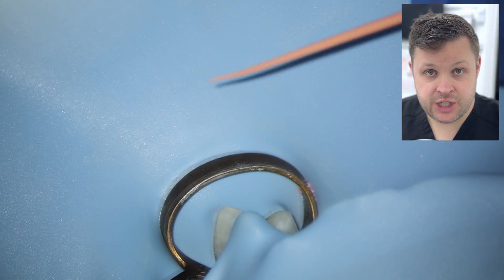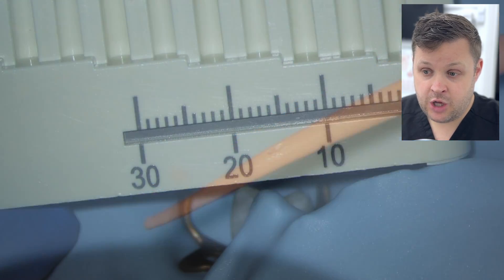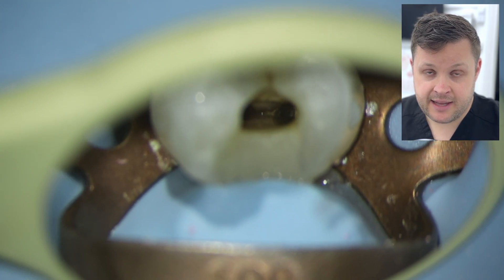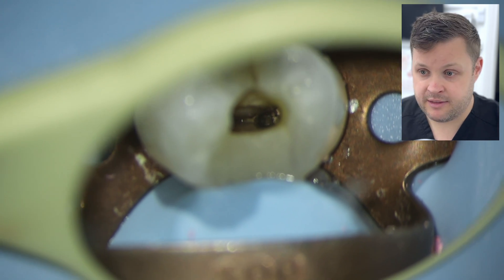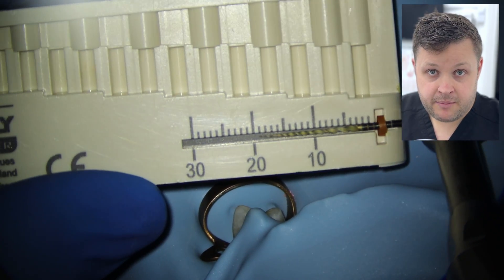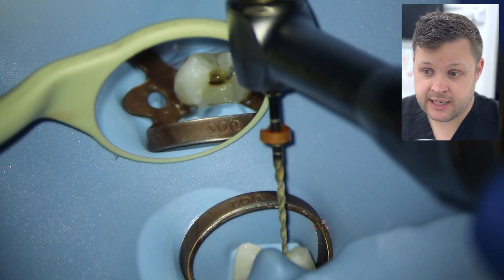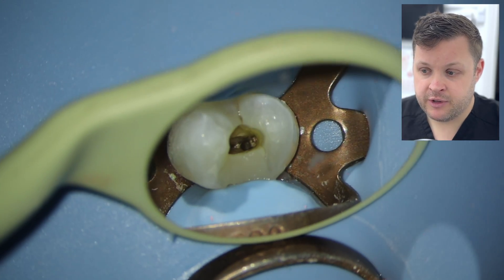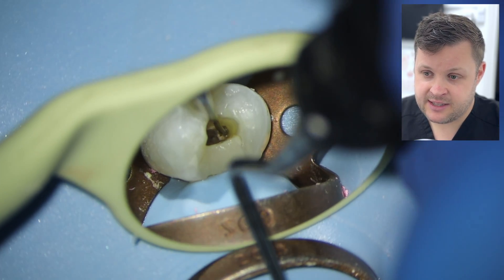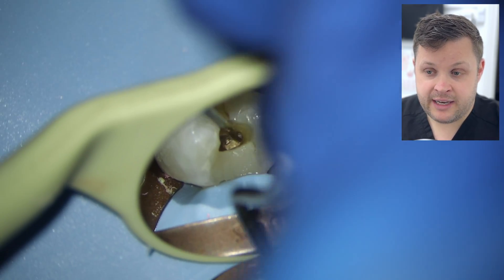I remove the file and inspect the GP point — it's made a mark, confirming the junction. Knowing where the join is means I can set all my files to this length and know I'm successfully cleaning the whole canal length. There's still some GP and sealer remaining, so I'm using the HyFlex file up to the junction point to remove it. That doesn't remove everything, so I use the DG16 probe to remove excess against the wall, being careful not to dislodge fragments without irrigant present, as they can drop and re-block the canal.